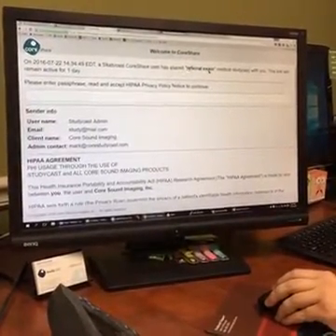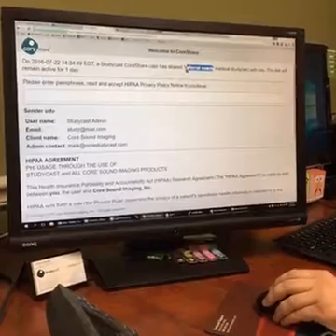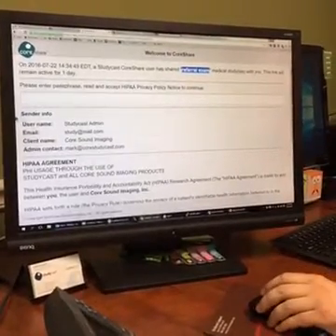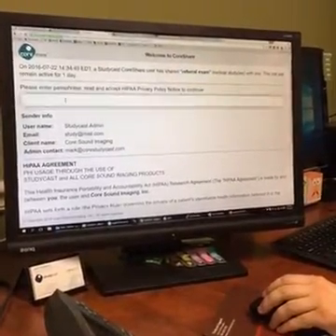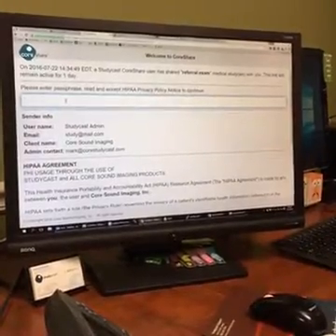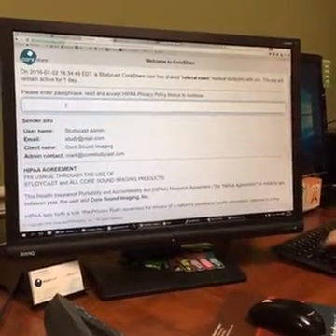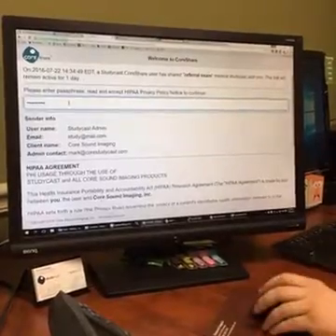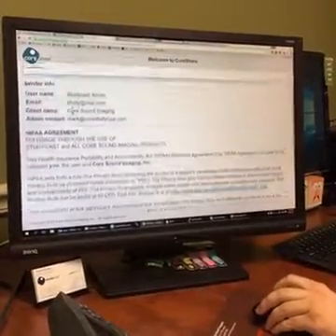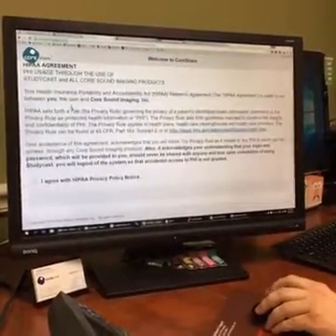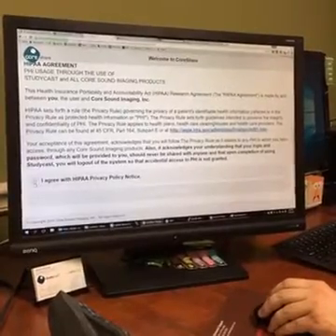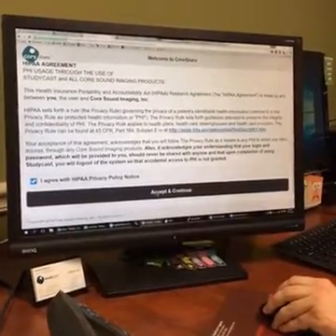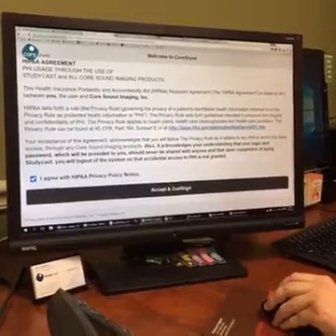And that's going to take me to the CoreShare interface. You'll see that the note that I put in when I typed the description shows up here, and it has a place to enter the passphrase that we set. So I'm just going to enter that passphrase of StudyCast. At the bottom here, you have to check the box to agree to the HIPAA Privacy Policy notice and press the Accept and Continue button.